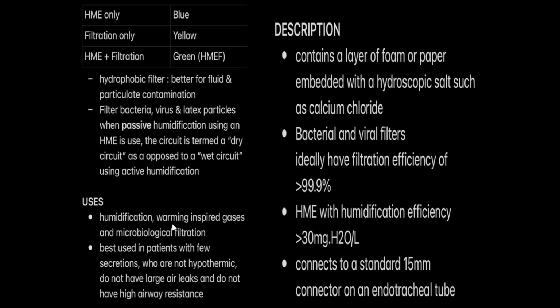It provides humidification, warming of inspired gases, and microbiological filtration. Best used in patients with few secretions who are not hypothermic, do not have large air leaks, and do not have high airway resistance. Because if a patient has very large secretions, you have to change it multiple times. That's one, and it increases the resistance. If the patient is hypothermic, the HME will always conserve the heat some more, and the patient becomes more hypothermic. And do not use with large air leaks or high airway resistance, because HME increases the airway resistance of the circle system.